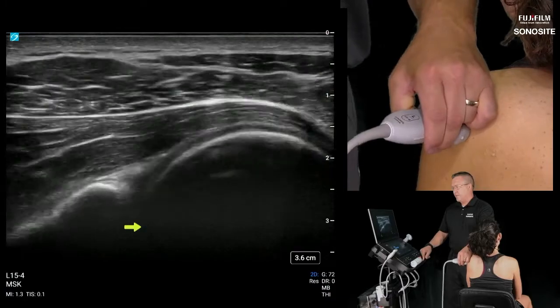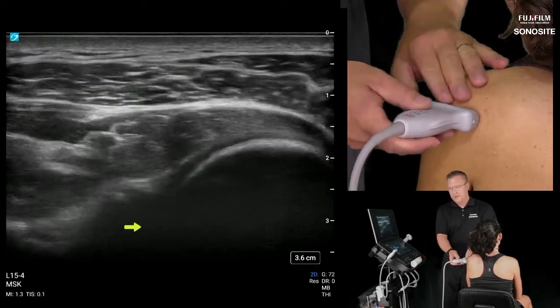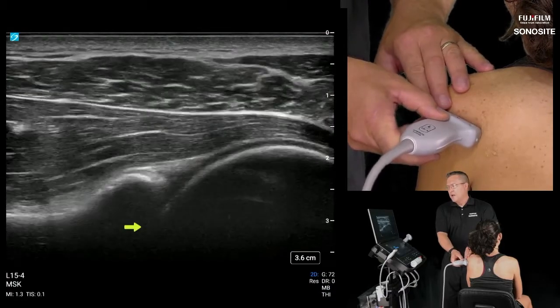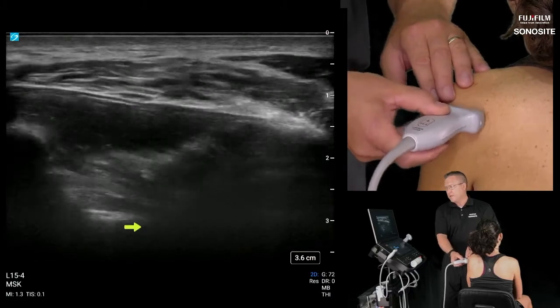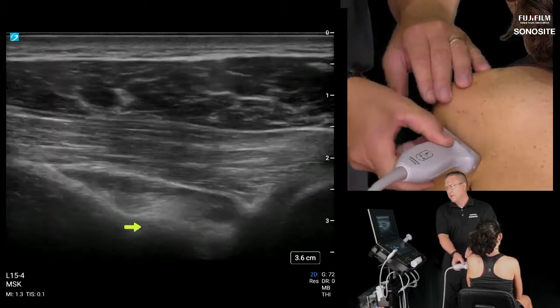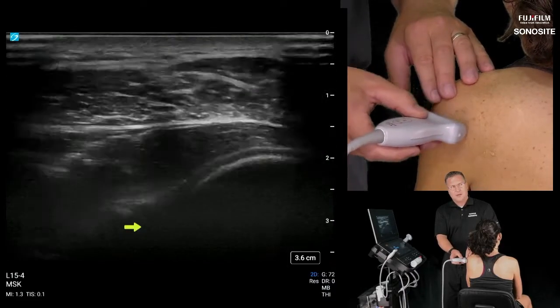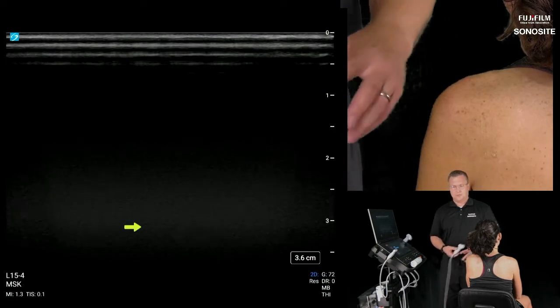That is the posterior shoulder from a rotator cuff in standard evaluation, minus the axillary nerve involvement back there in the quadrilateral space and quadrangular space. But from reviewing the infraspinatus tendon as a rotator cuff structure and the teres minor as a rotator cuff structure, those are the standard things to look for. I would say the teres minor is very forgotten in the shoulder exam. Almost nobody looks at it.